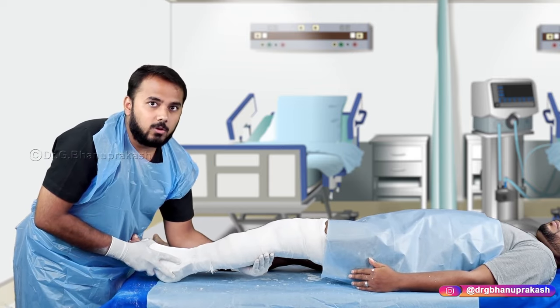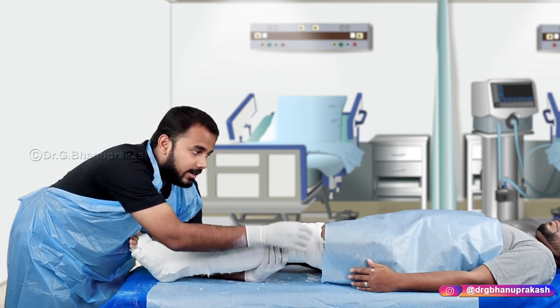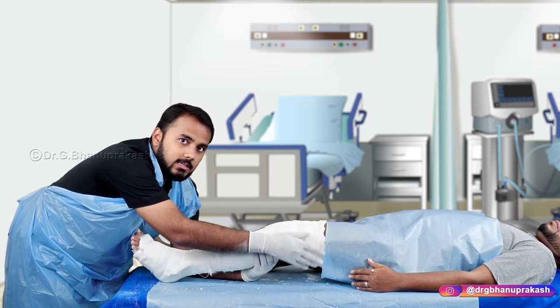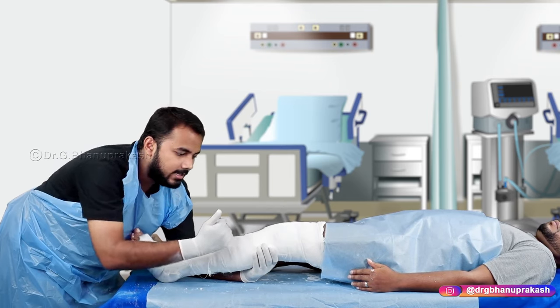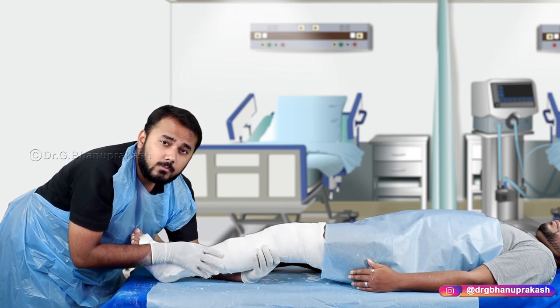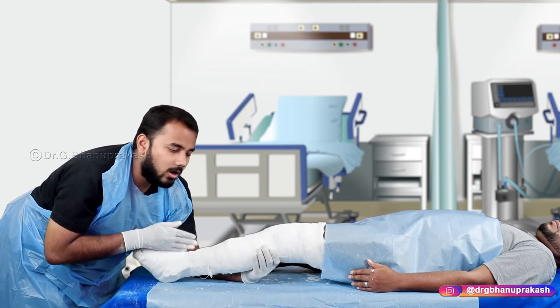After setting, keep the patient's leg in a neutral position: flex the knee and place a pillow underneath, so the extensor and flexor muscles of the thigh and leg are all relaxed and not contracting. This achieves successful immobilization of the joint, prevents movement of the fracture fragments, and aligns the displaced fracture fragments in a single line.